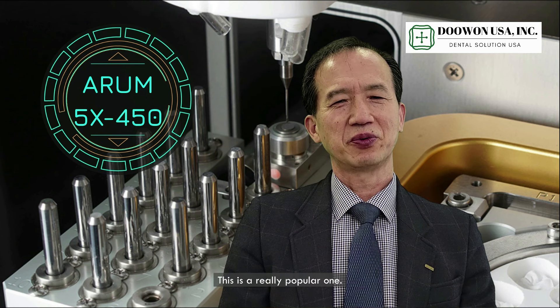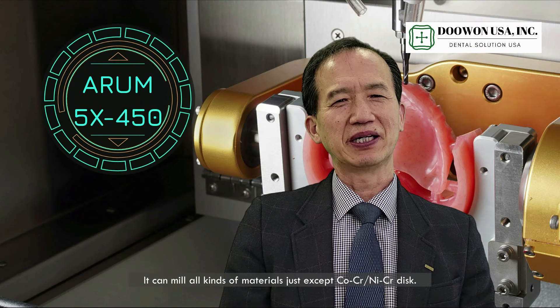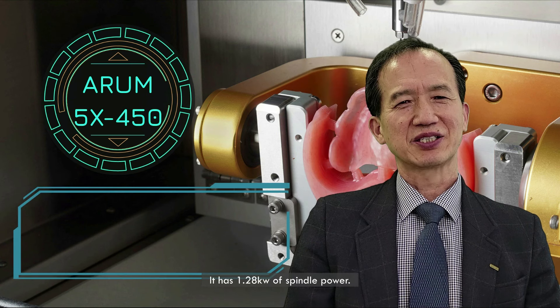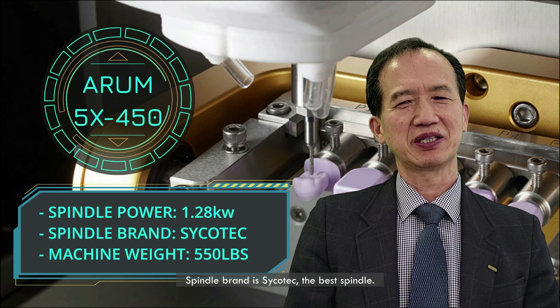This is a really popular one. It can mill all kinds of material, except cobalt chrome or nickel chrome disc. It has 1.28 kilowatt spindle power. The spindle brand is Sycotec — the best spindle.